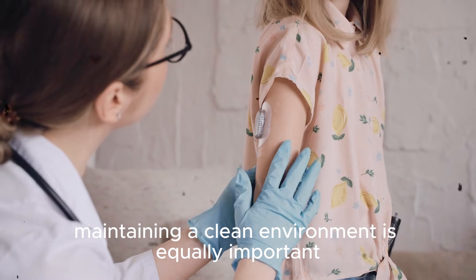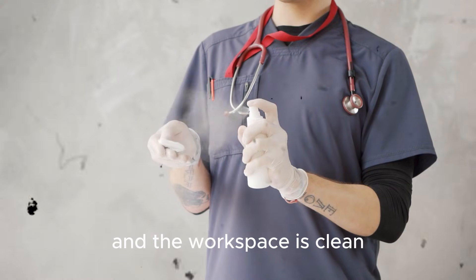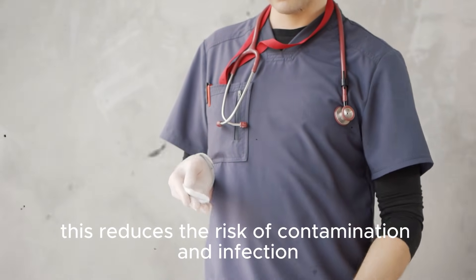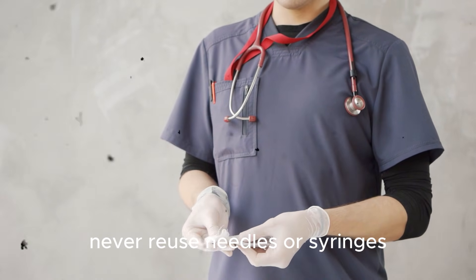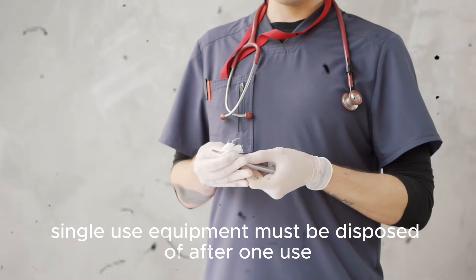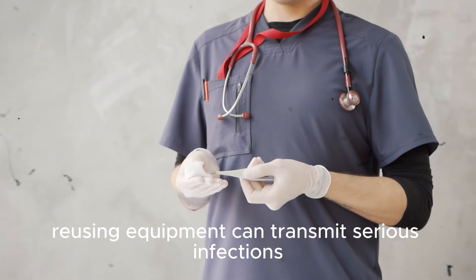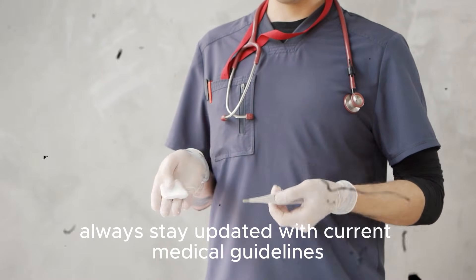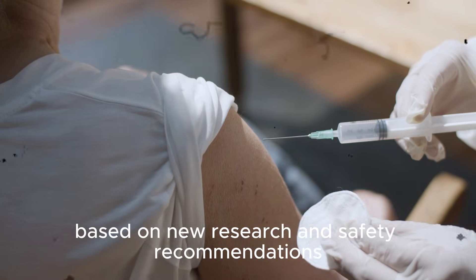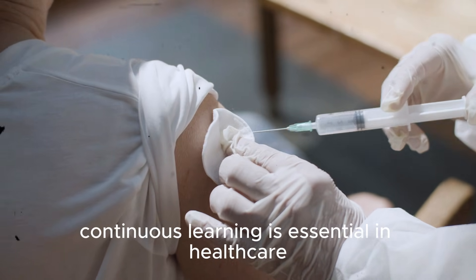Maintaining a clean environment is equally important. Ensure that all equipment is sterile and the workspace is clean — this reduces the risk of contamination and infection. Never reuse needles or syringes; single-use equipment must be disposed of after one use, as reusing equipment can transmit serious infections. Always stay updated with current medical guidelines, as injection practices may change over time based on new research and safety recommendations.